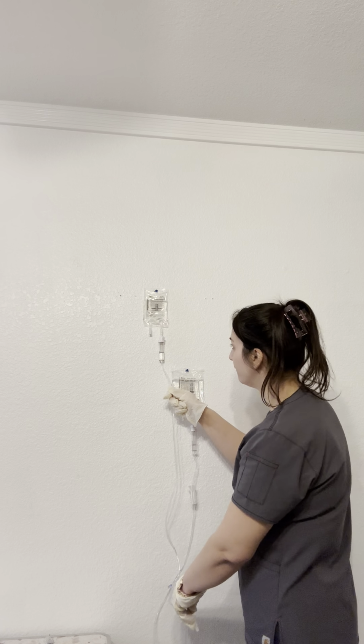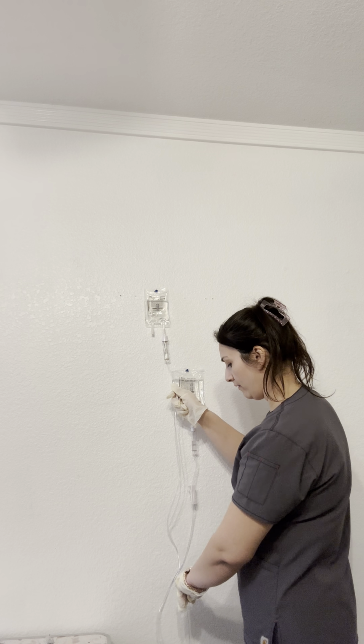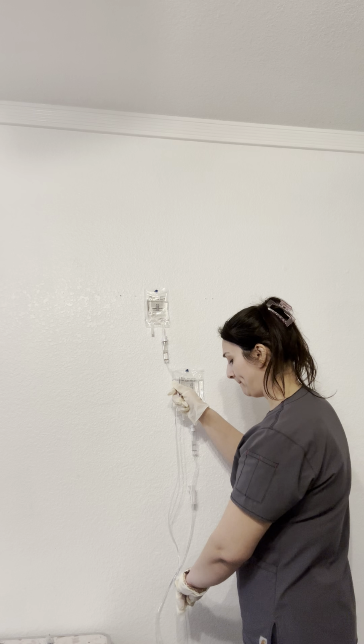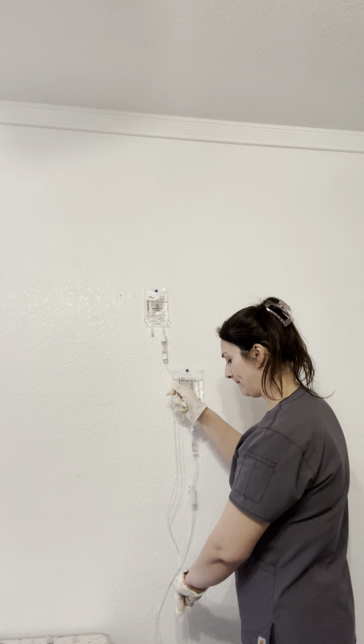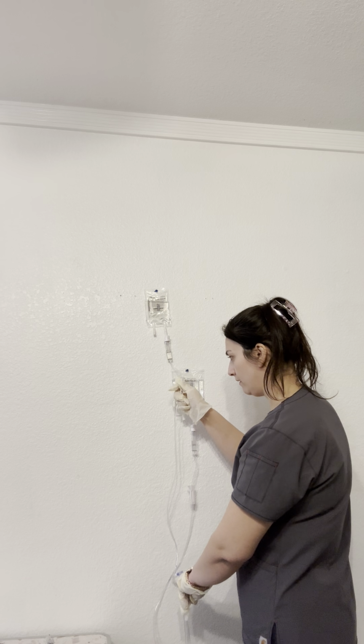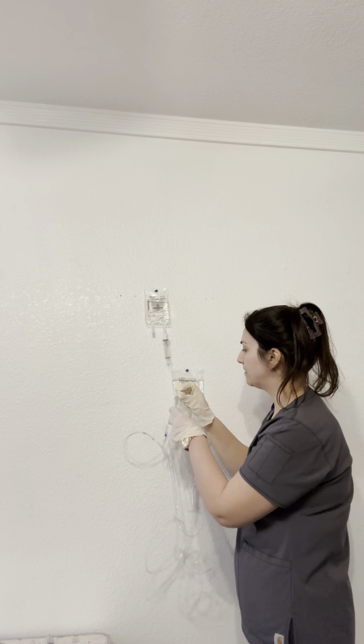We're going to adjust it. Okay, I have counted that. It's 100 drops per minute.